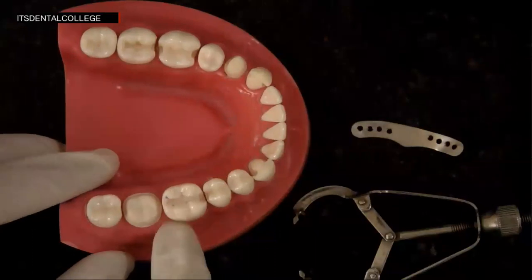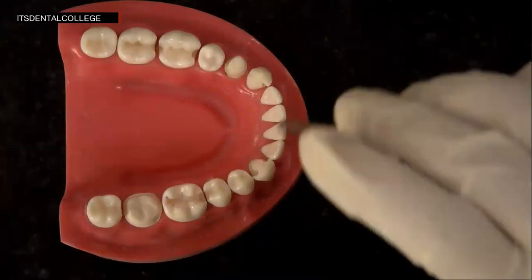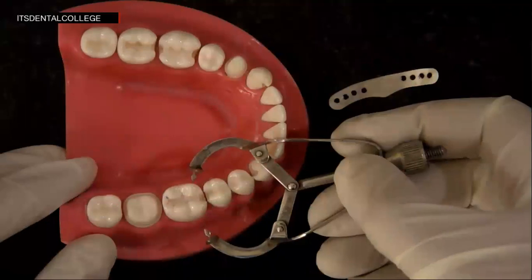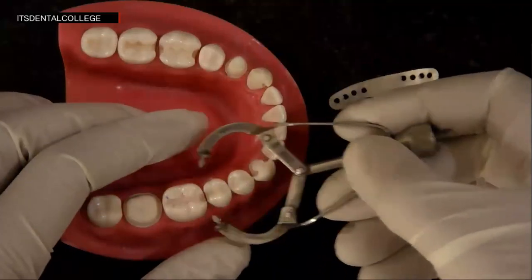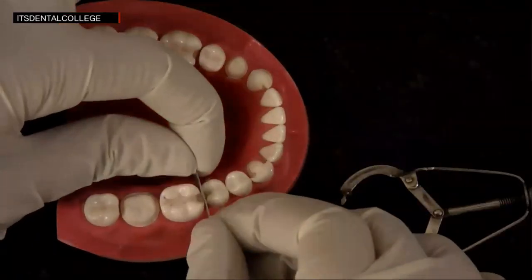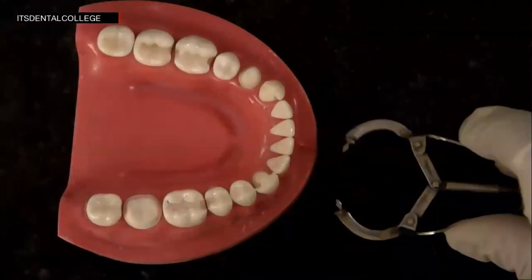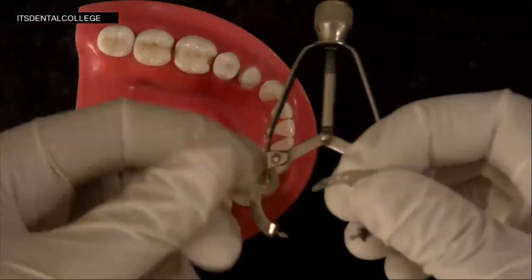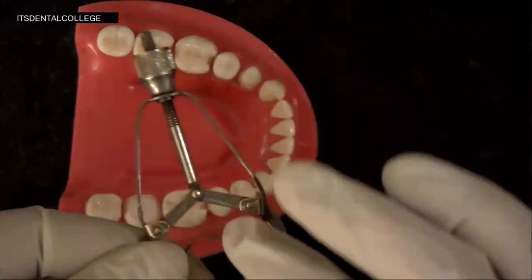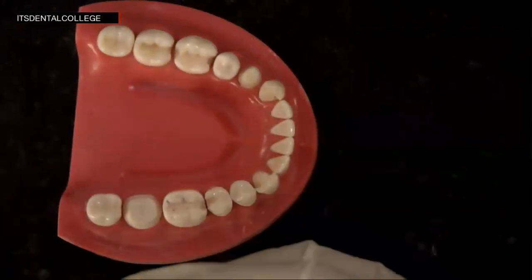So again, we'll be placing the band on tooth number 46. This is the band. It has holes within it. Depending on the size of the tooth, we have to see which loop we need to engage it in. So depending on the loop, we have to engage it within the projections. We engage the band within the retainer.